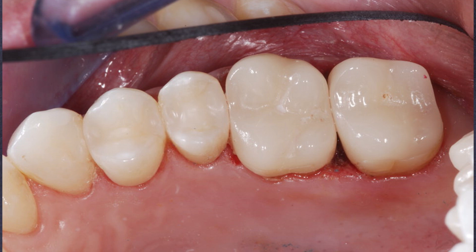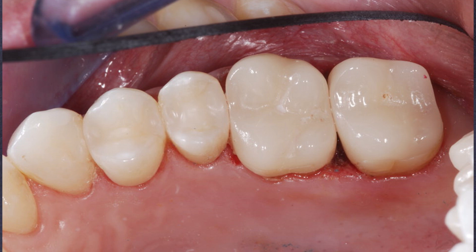Let's take a look at the end of this case — what a fantastic result, and that's going to serve that patient for a long time. It's a little more conservative, might take you a second longer to do, but you're going to be more happy with those results.